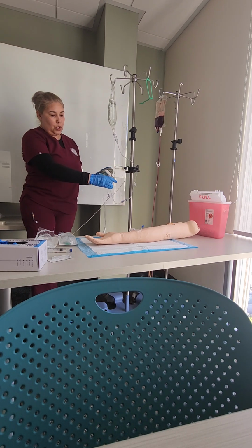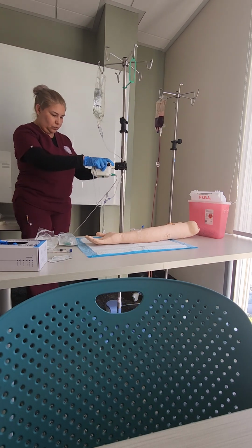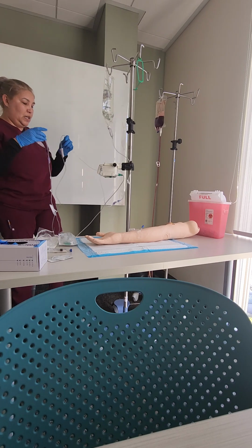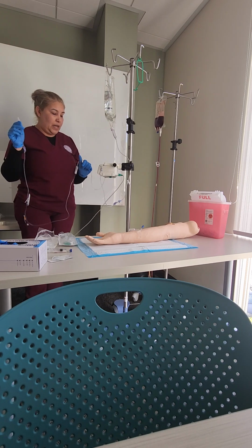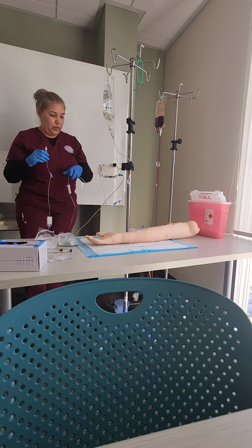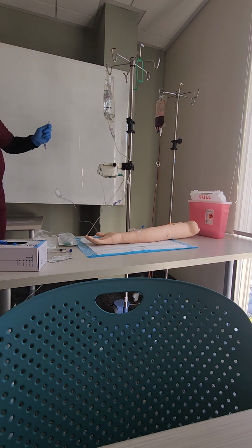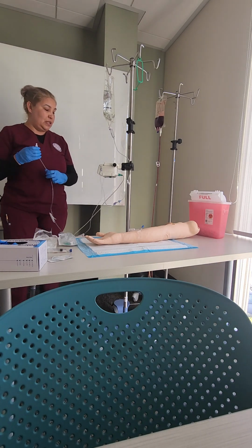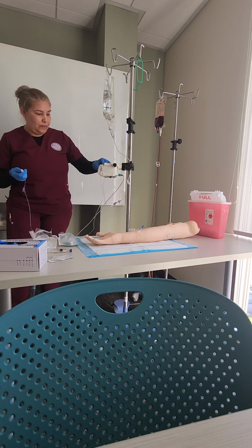I want to make sure there are no kinks in my tubing. I want to close that up. And I want to make sure that I am maintaining sterility, and I do not want to plug this into my patient until I know that I have primed it and it is ready to go. I'm going to grab my trash because it's going to prime. I want to make sure that I have a trash can or something by the side because it's going to ask me if I want to prime it, and I'm going to say yes.